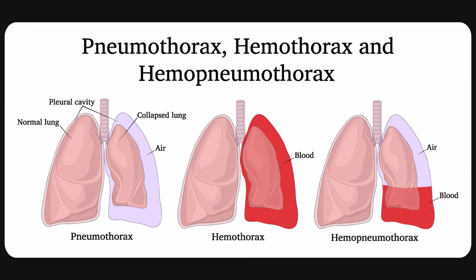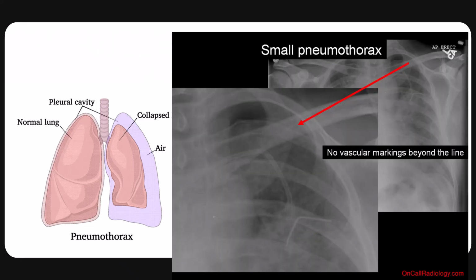Pneumothorax, hemothorax, and hemopneumothorax require the radiographer to be extremely critical in choice of exposure and positioning. We must be able to demonstrate lung markings, air, and fluid levels to determine whether it is a hemothorax, a pneumothorax, or a hemopneumothorax. Remember, many pneumothoraxes are not very big, and the only way you can see them is a slight variation in the lung markings.